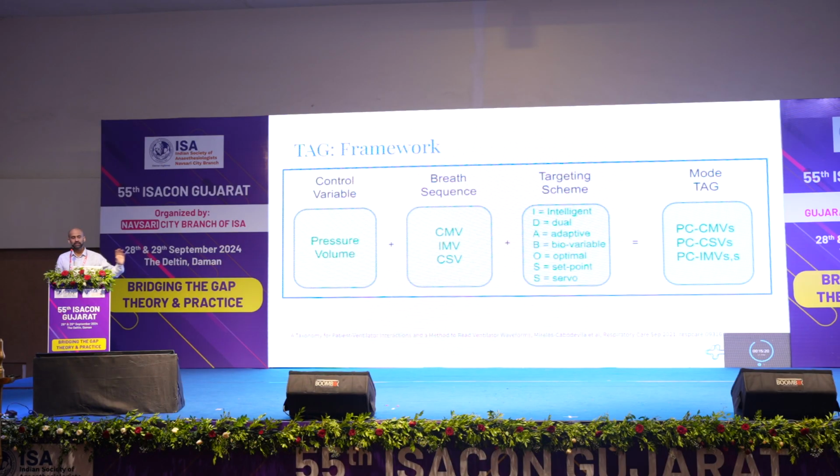As a recap, this is how you typically tag modes. I will not be covering this in this talk. I'll share a QR code with you. You can join us on a free WhatsApp group where we continuously discuss and practice how to tag modes. But the essence is that if you look at the tag column on the other side, that is how modes are named as if they were generic medicines.